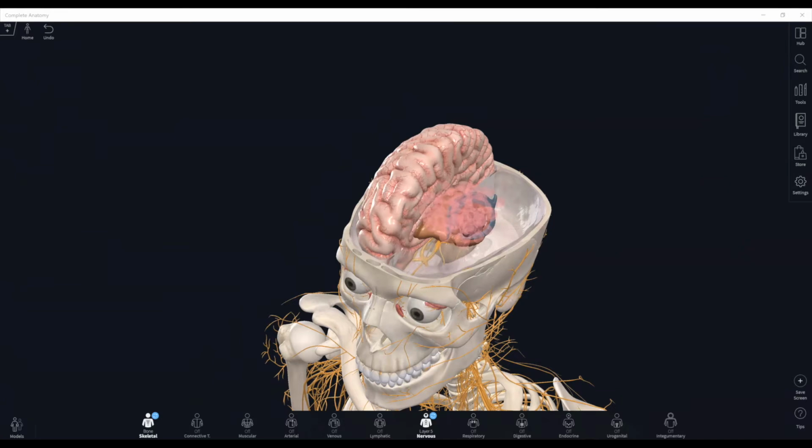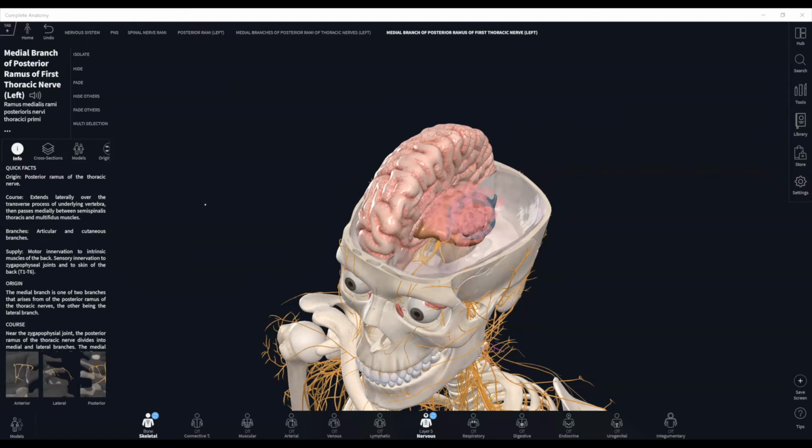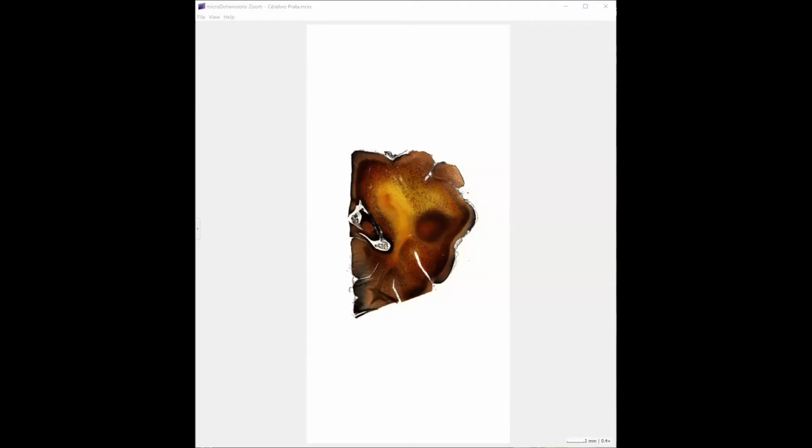This is what you saw here. Now we will open the histological part of the solution. So we gave a macro overview. We had the reconstruction from the real patient, and we are associating this to the atlas. So you can use the atlas and say, okay, this is connected to the circle of Willis, to the carotids, to whatever arteries you want to talk about, or whatever circuit in the brain, or you can even talk about the phases to access this tumor in this case.